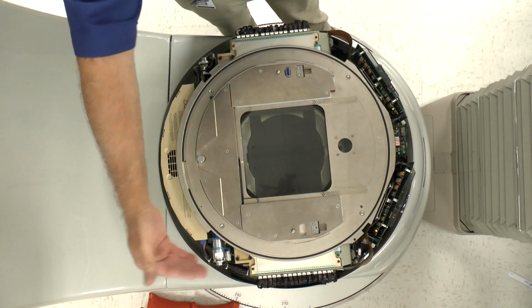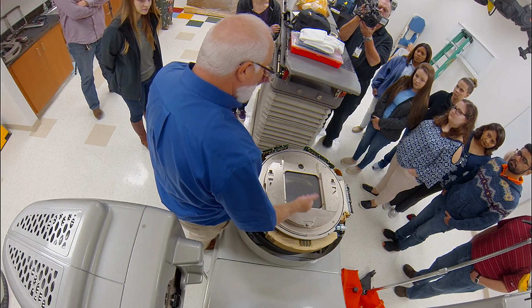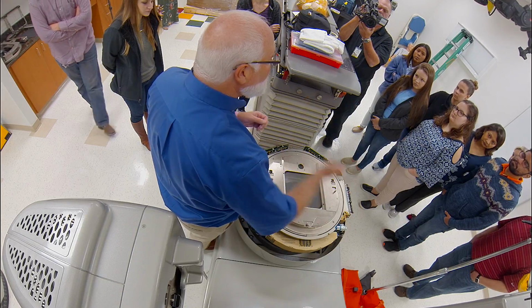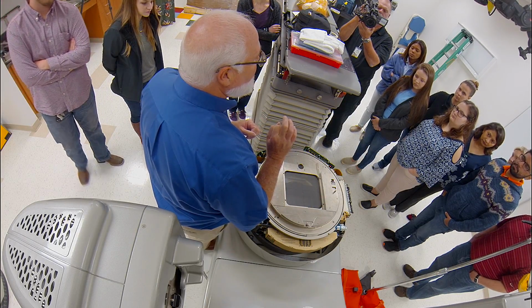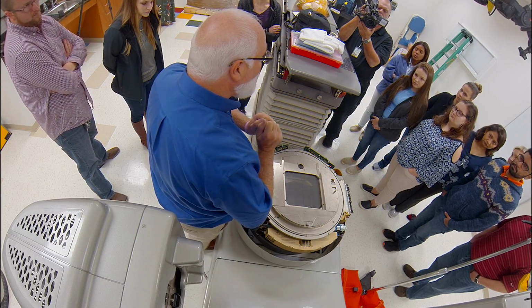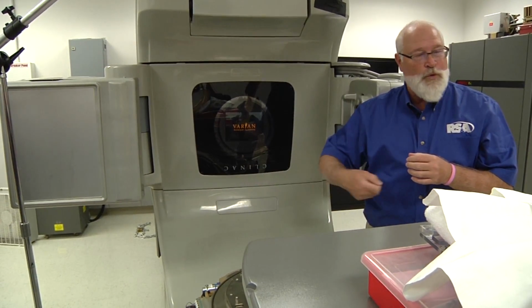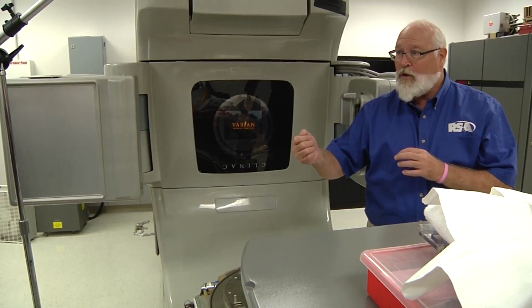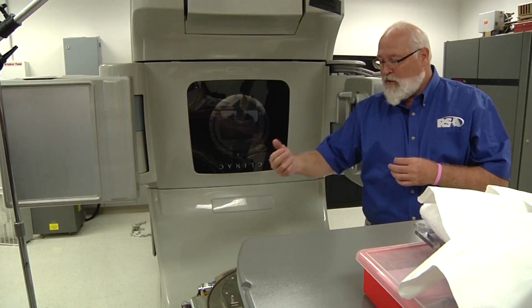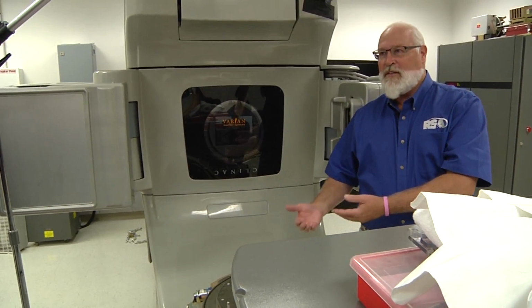So if you go all the way back and you're at its hard stop and you keep trying to retract that leaf, Varian built in to the leaves, to protect the leaf screws, the drive screws, a little T-nut. And it's a little bit of plastic. That's what pulls the leaf back and forth. You'll break that nut. And so then your leaf will move freely. It'll slide in between the grooves without any friction. So that means now you have to replace the T-nut as well.